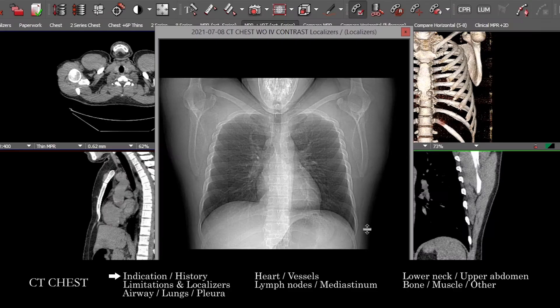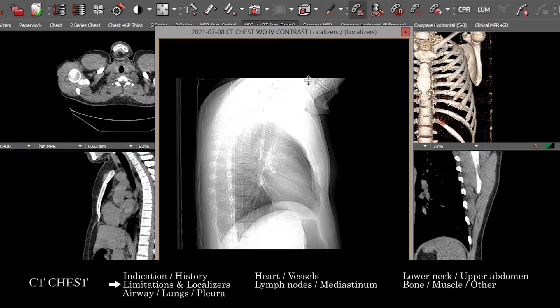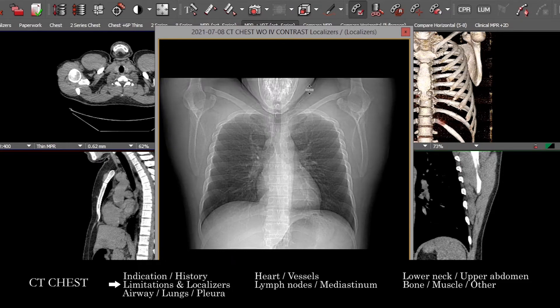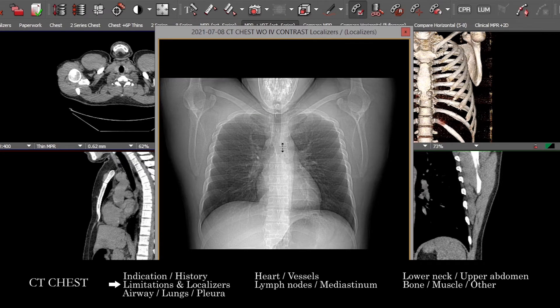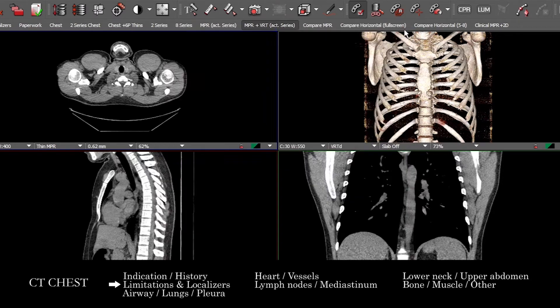To begin, once you've gotten a sense of why the study is being done and what we're looking for, I like to take a quick look at the localizer images — especially in areas of the anatomy at the superior and inferior aspects of the study, which we sometimes may not see entirely in the axial images. This can also give you a sense of overall distribution of pathology, and any sort of support devices, to key you in to make sure you're looking at those.